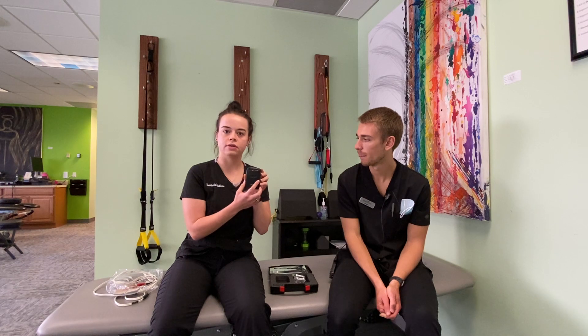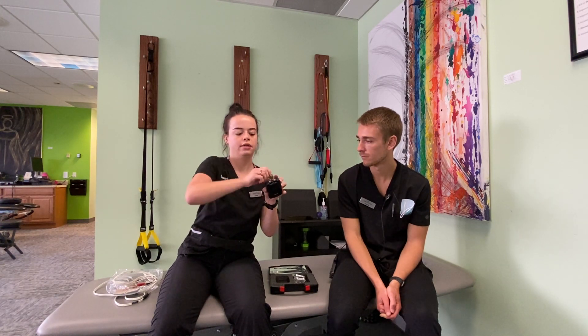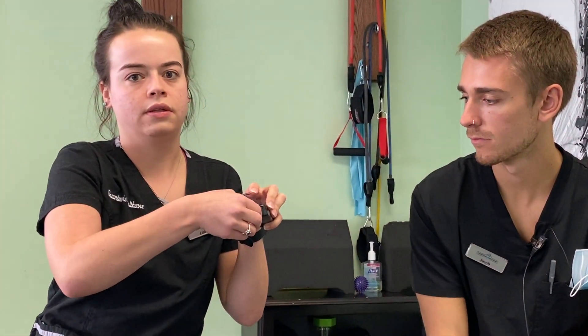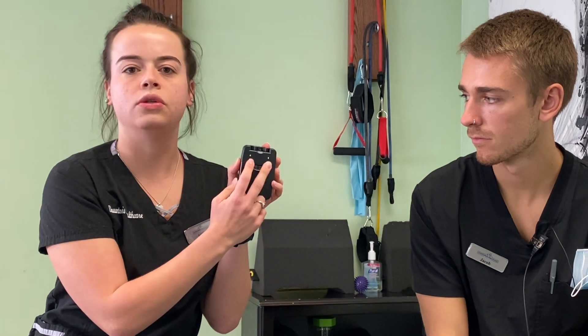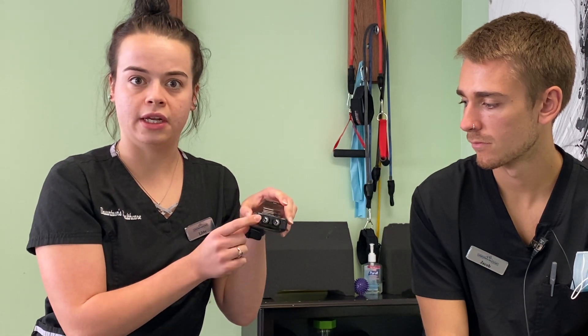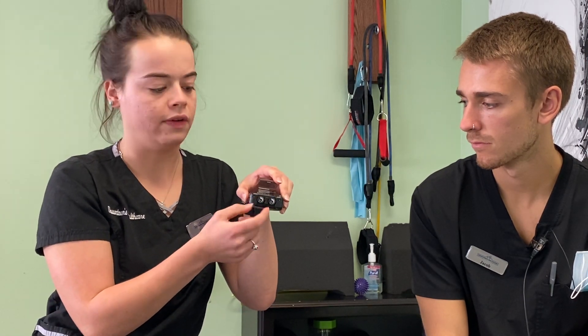How this TENS unit works is you open up the flap right here and you'll see two dials. You'll turn the dial, you'll hear two clicks, and you'll also see two yellow lights come on, meaning both of these ports are on and ready to go. To control the intensity coming out of each port, you have both dials here. Ideally, you want the dials about the same.